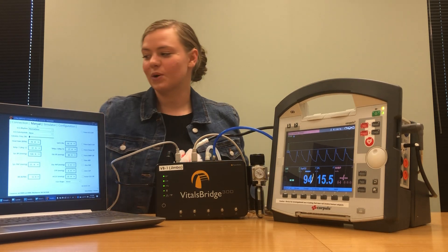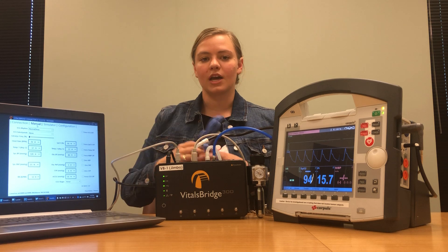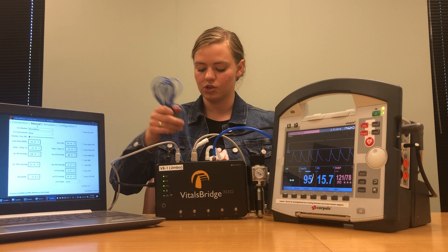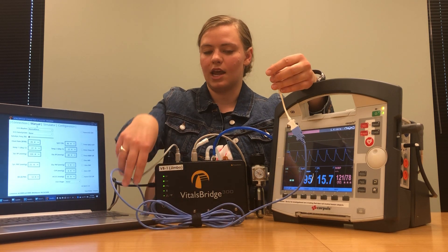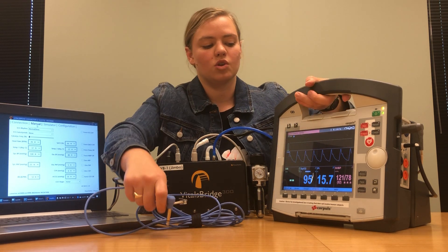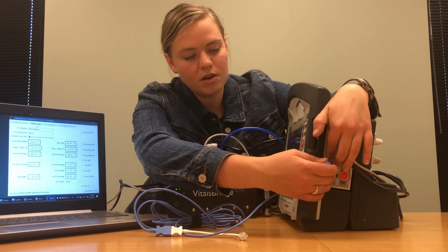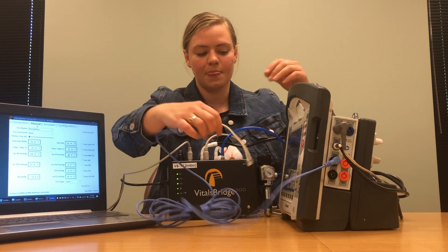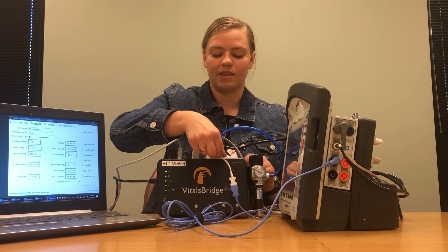Next we're going to connect our temperature cables. The VitalsBridge 300 supports two different temperature measurements, and your VitalsBridge should come with a temperature cable that has one end connecting directly into the VitalsBridge and one end connecting into the patient monitor. Right where it says temperature one on the patient monitor, plug in the first cable, and then take that end and plug it into the spot that says T1.